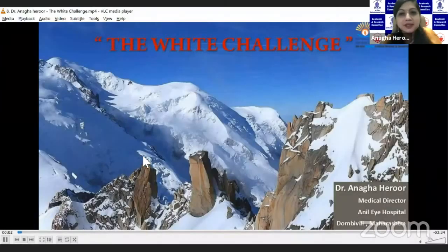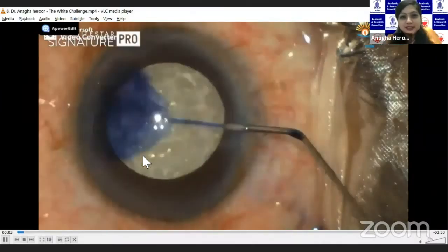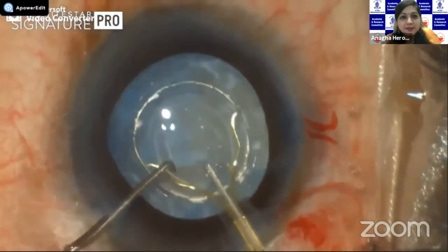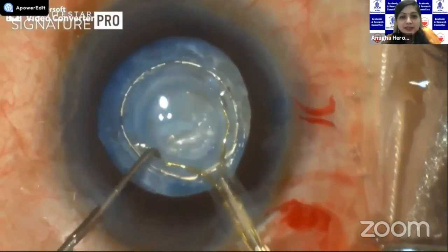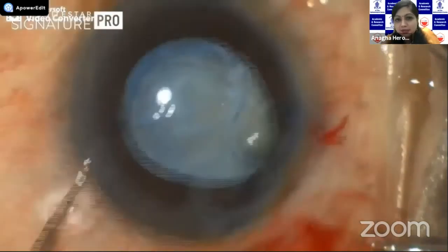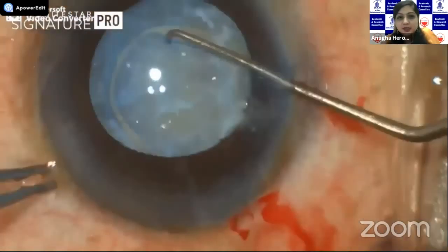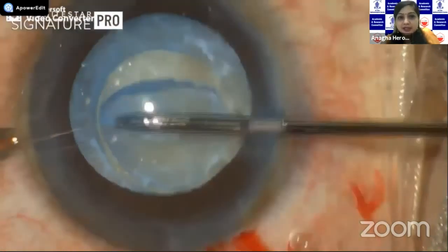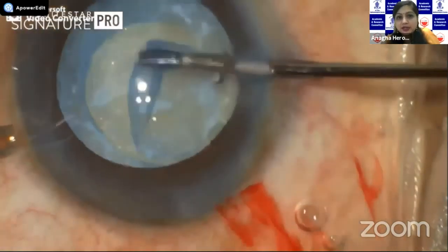This is a very simple video — actually the white challenge. This was a 71-year-old male who came with a hypermature cataract and a patchy anterior capsular fibrosis. As you can see here, we have stained the capsule with trypan blue and are using a zepto-assisted capsulotomy. In such cases, well begun is half done. If I had attempted a manual rexis, there would be a high risk of an anterior capsular tear.